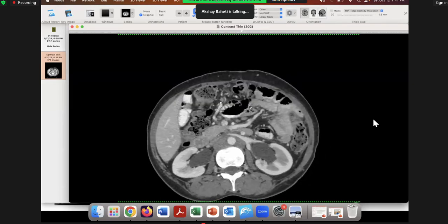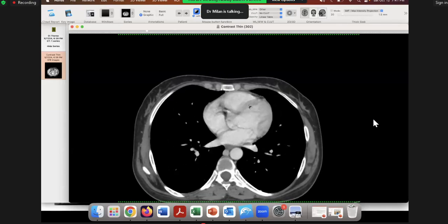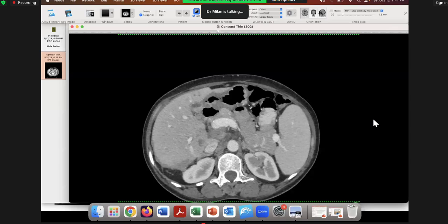All right. You were saying something? Yes, sir. My doubt was the same: if we see mesenteric lymph nodes, whether it is due to disease deposits or whether we can ignore it. Generally, I would say ignore it. The only exception is if it's a colonic cancer. Colon cancer or small bowel cancer will obviously drain into the nodes. They are draining nodes.